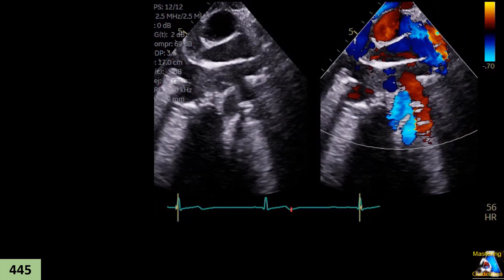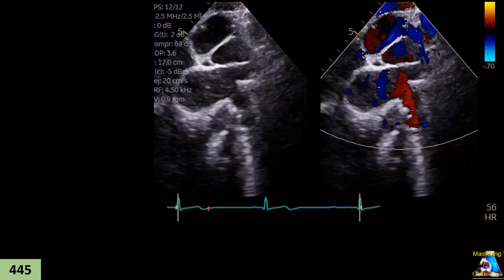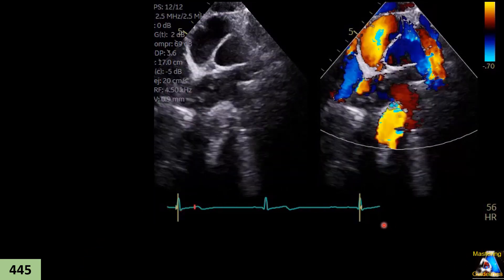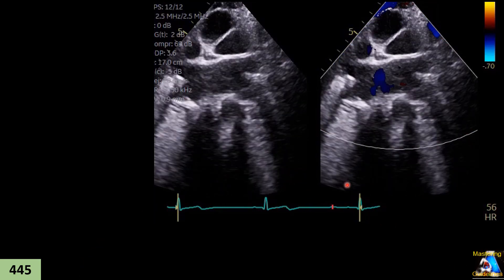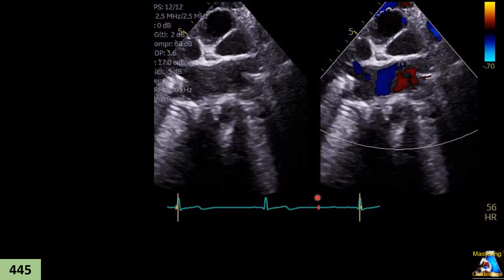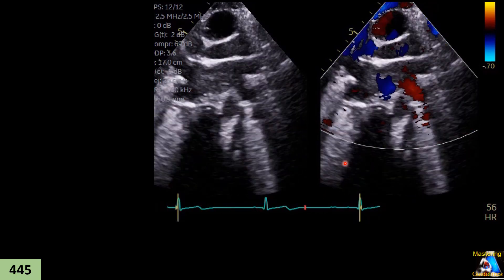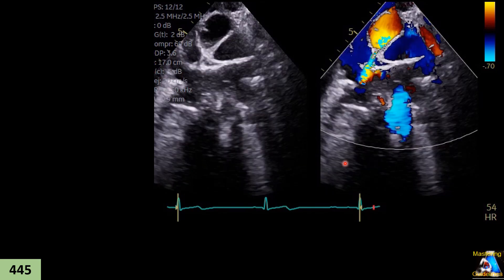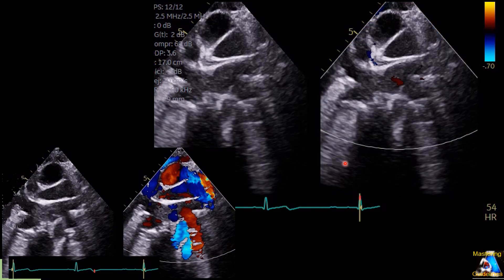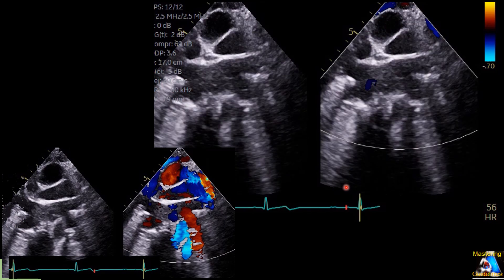We have a teenager patient for follow-up. We obtained a supra-sternal window view. First, what view is this based on the structures you can see? Second, the marked structures — can you name those structures?